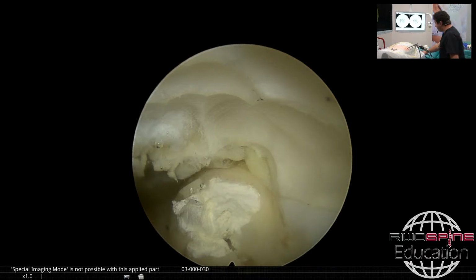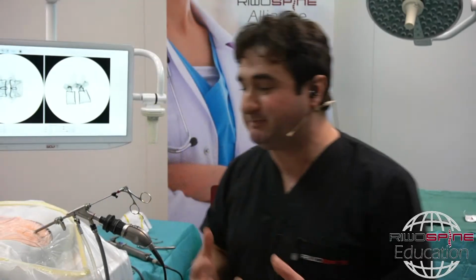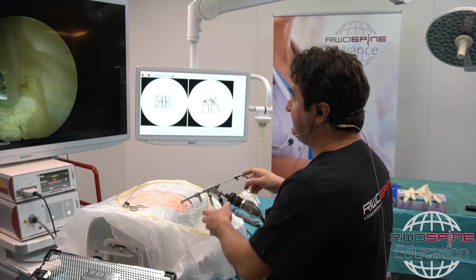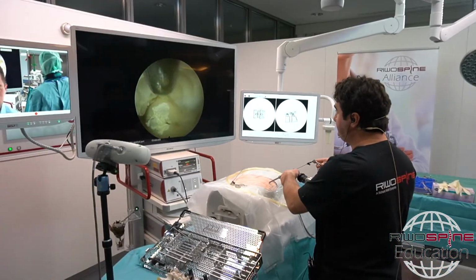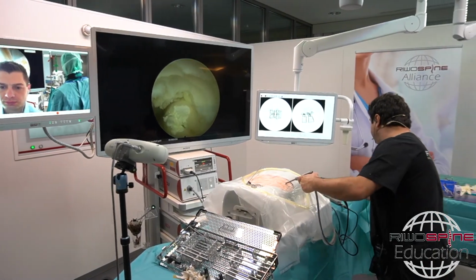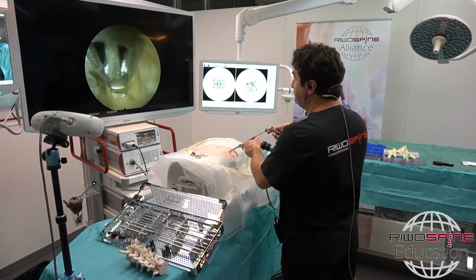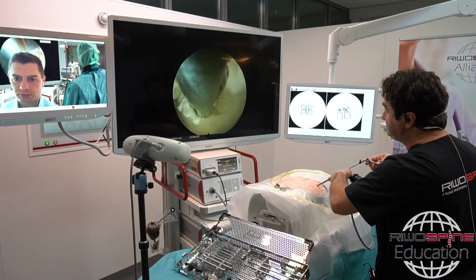Yeah, it is better because, as you see here, the principle of the full endoscopic approach is based on seeing what you do. If you use 2.5 millimeter instruments and rotate your system, then you see what you are doing. But if you are using, for example, the 4 millimeter instruments, you see, it blocks everything, the view, I mean.